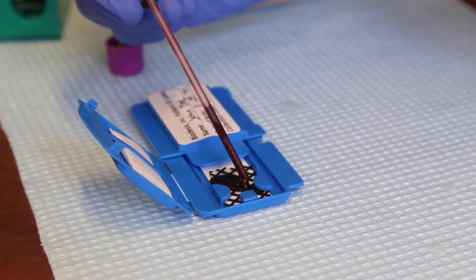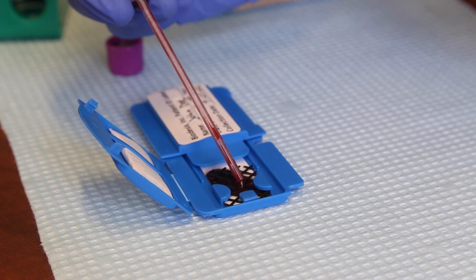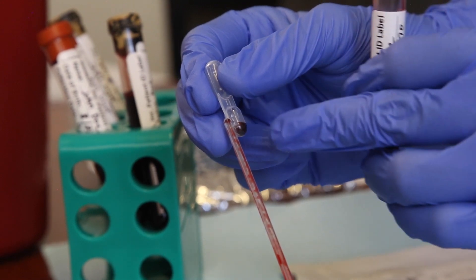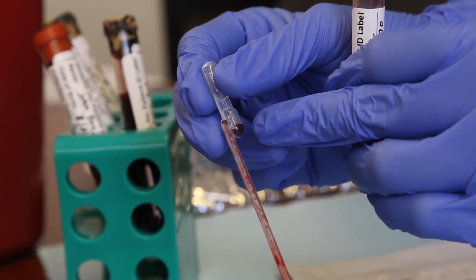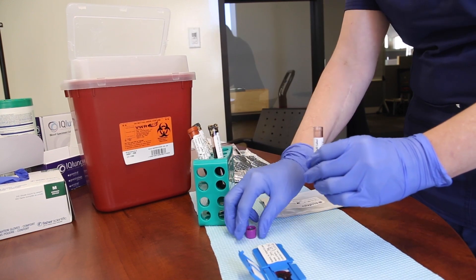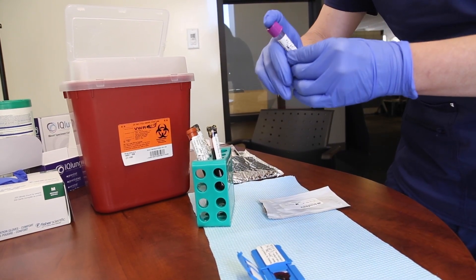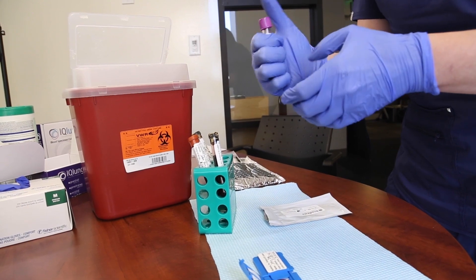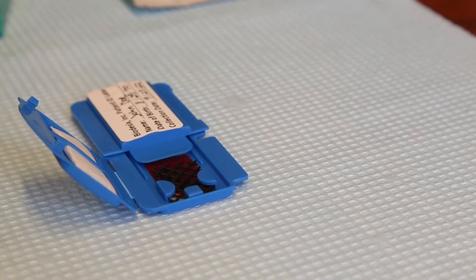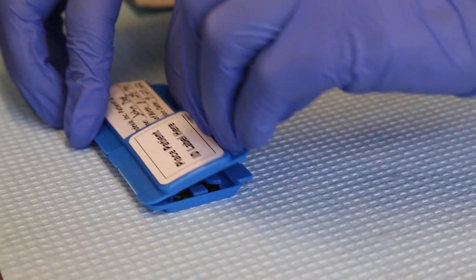Then, fully depress the top bulb once to release the blood onto the black mesh in the biodesics collection device. There may be residual blood volume in the pipette reservoir after dispensing — do not attempt to fully empty the reservoir. Safely discard the purple topped tube and pipette. Wait 2 to 3 minutes for blood to fully absorb. Do not move or close the device until after 2 minutes.